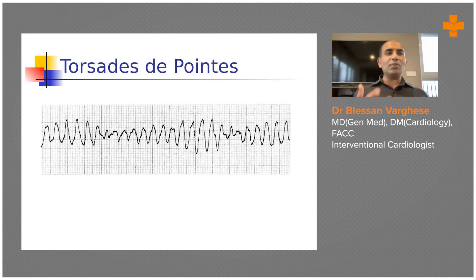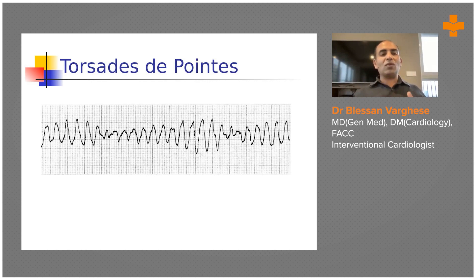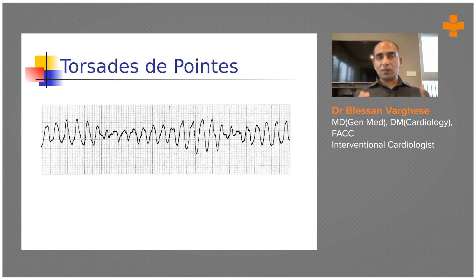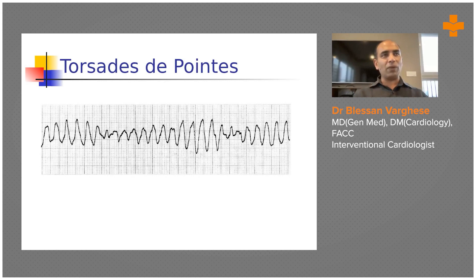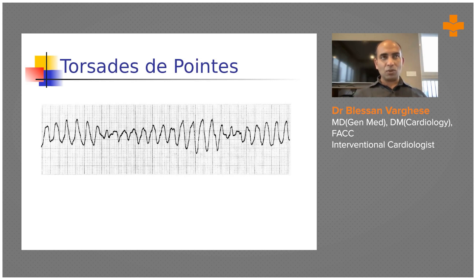These ECGs are shown to generate enthusiasm for learning. In polymorphic ventricular tachycardia, you can see an undulating rhythm where each ventricular complex is morphologically different from the others. This is usually seen with drug-related ventricular arrhythmias, and especially with hypokalemia and hypomagnesemia causing prolonged QT syndromes. Treatment is IV magnesium sulfate or cardioversion. Importantly, do not give amiodarone, as it prolongs the QT interval and can precipitate Torsades.